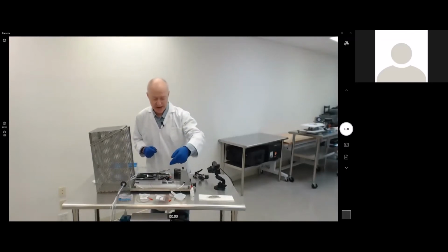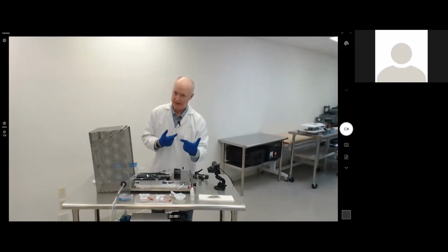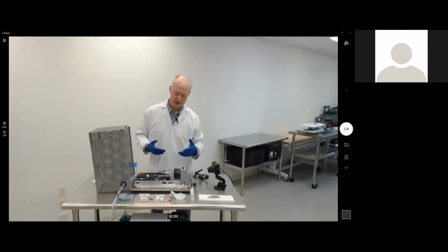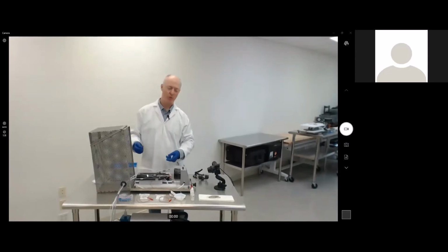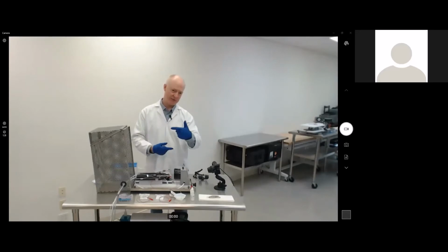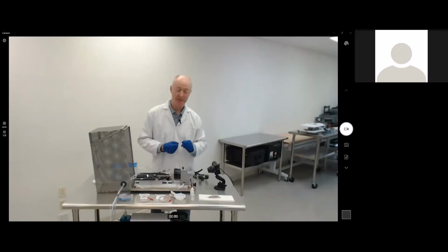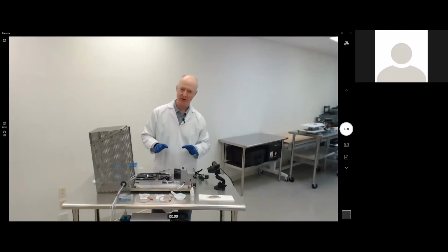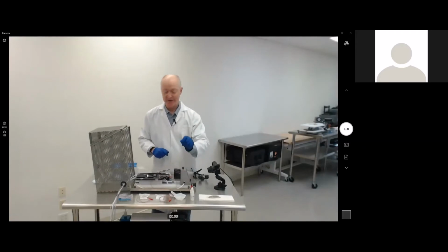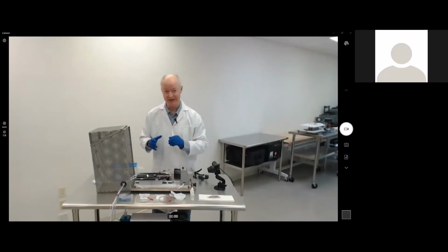Later on, I'll be doing a second, so I have a second pair out here as a backup. And if I'm conducting ERGs on multiple animals, I would recommend that you actually have two pairs. One's being used and one's being cleaned and then replaced and alternated between the animals if you're doing multiples in a day. Having some distilled water handy with a pipette is always very helpful. Sometimes just put a drop on the eye to keep it hydrated, but it also helps increase the conductivity and reduce some of the impedance. So that's a nice little trick.